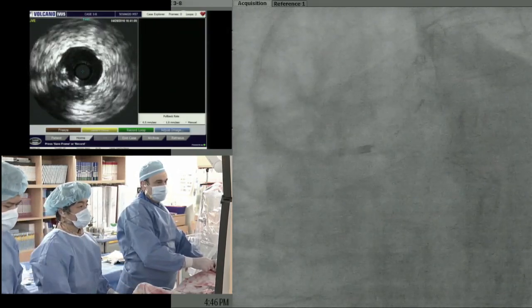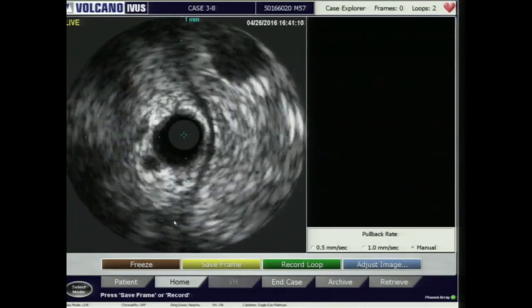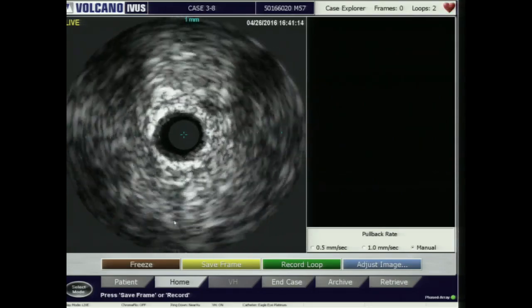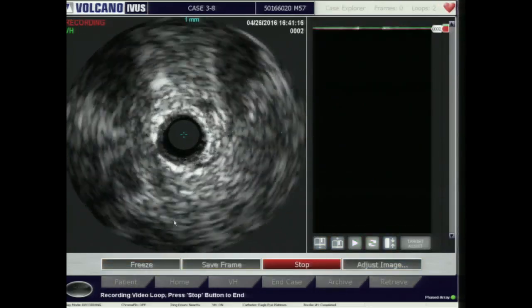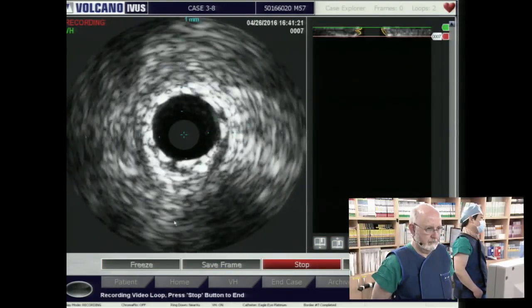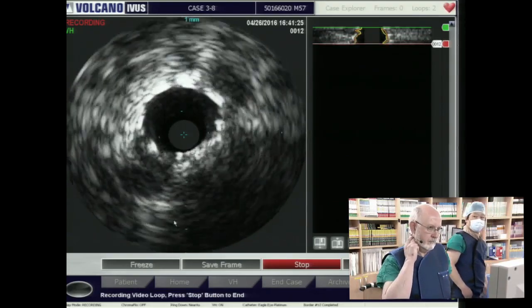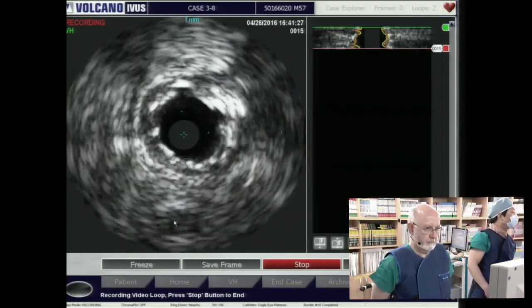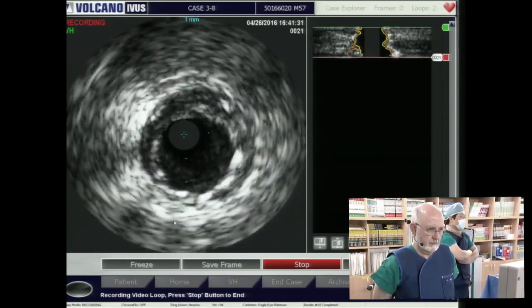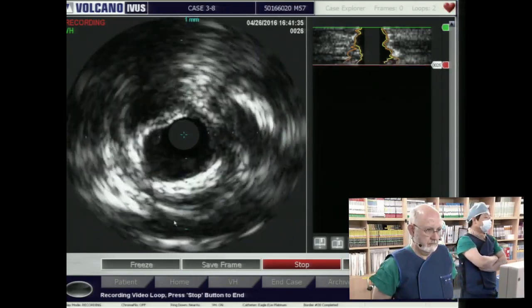Doctor, even in the left main, in Korea very few people are doing the final kissing balloon. Okay, say pull back. In Korea we are now doing a multi-center randomized trial. One is the true bifurcation, the other is non-true bifurcation. In this series, now 110 are non-true bifurcation. We are randomizing into mandatory final kissing balloon versus just leave it, and we are accumulating data.